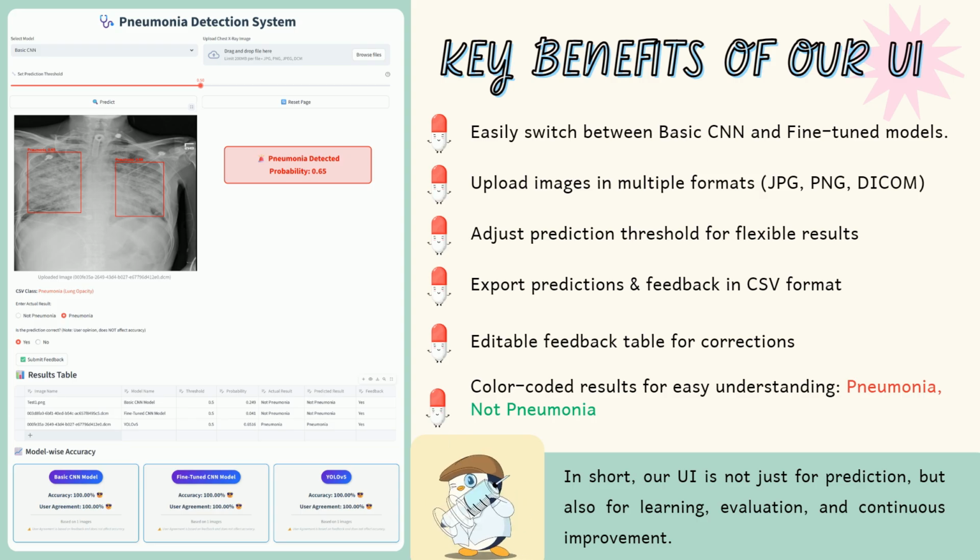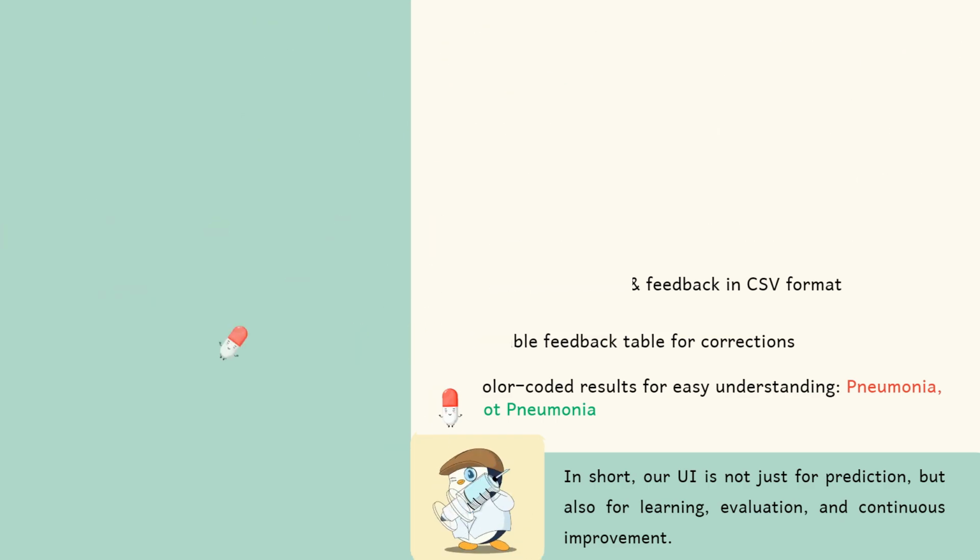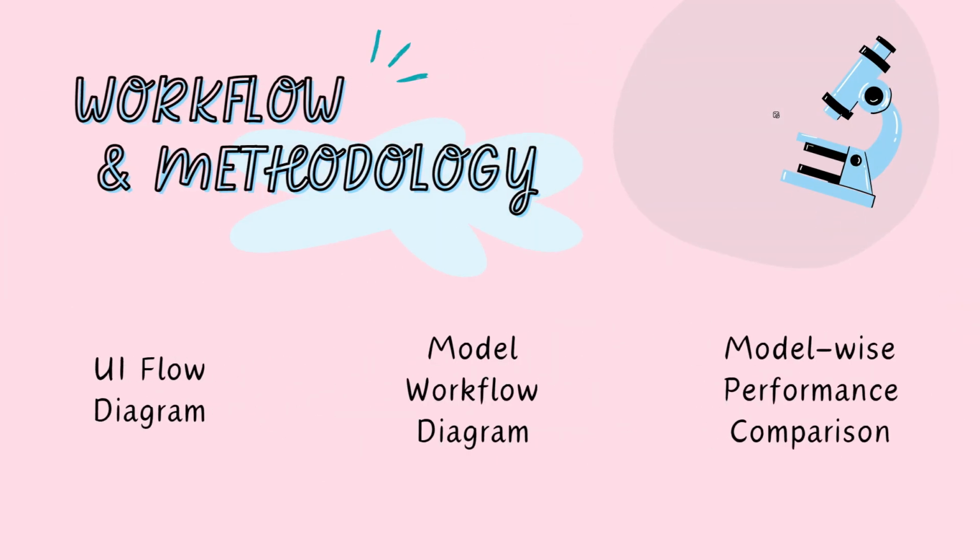And with YOLO V5, you get visual explanation, not just predictions. In short, this is not just a prediction tool. It is a complete system for diagnosis support, evaluation, and continuous improvement. Now, workflow and methodology. We'll cover the UI flow diagram, model workflow diagram, and model-wise performance comparison.